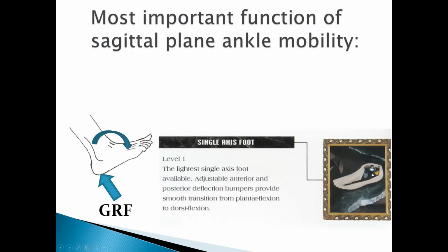So here is an example of a single axis foot. So this here, this ball is actually just an interface with the socket. So there'd be a bolt that would go here, and then probably a collar that would go around, so you have a nice solid connection between the foot and the pylon here. And then here is the axis.